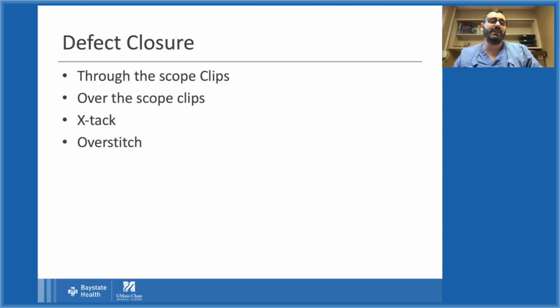So now, what do we do with the defect after we remove the polyp? Do we close the defect? Do we close the polyp site, or we keep it open? There's really no good consensus on this. Some people prefer to close everything. Others do not. Sometimes, even if the polyp is really large, you cannot technically close it. Just like that largest polyp I've ever seen. I told you that polyp, there's no way that site can be closed.